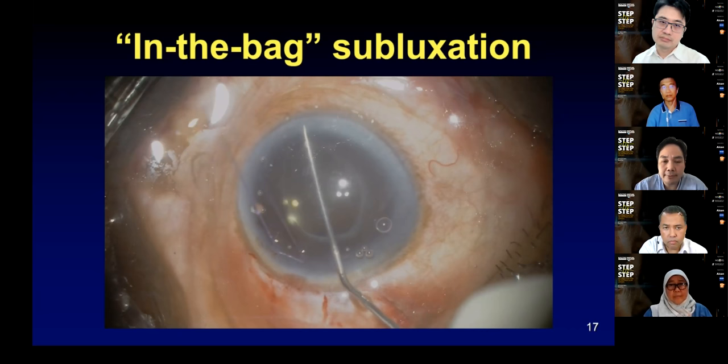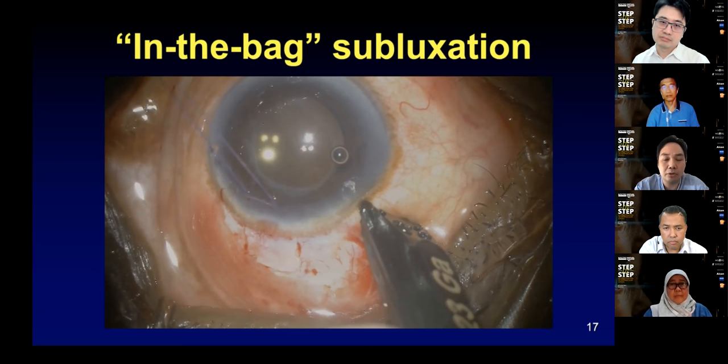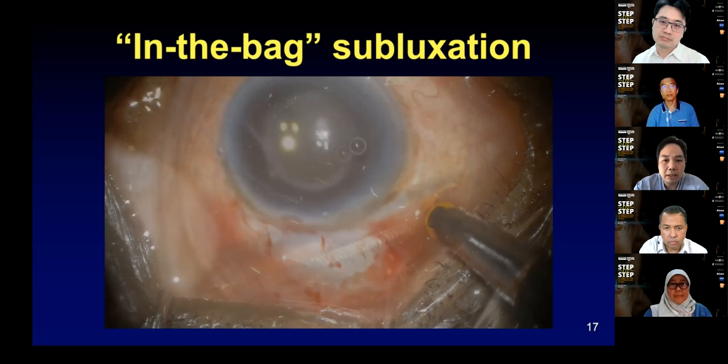The lens doesn't look too far off, subluxated in the X or Y position, but in the Z axis it is sitting quite far down towards the vitreous cavity. So I'm starting off, and I think this is one of the points that I want to highlight. Perhaps I'm biased being a VR surgeon as well, is that you need to do a good vitrectomy.